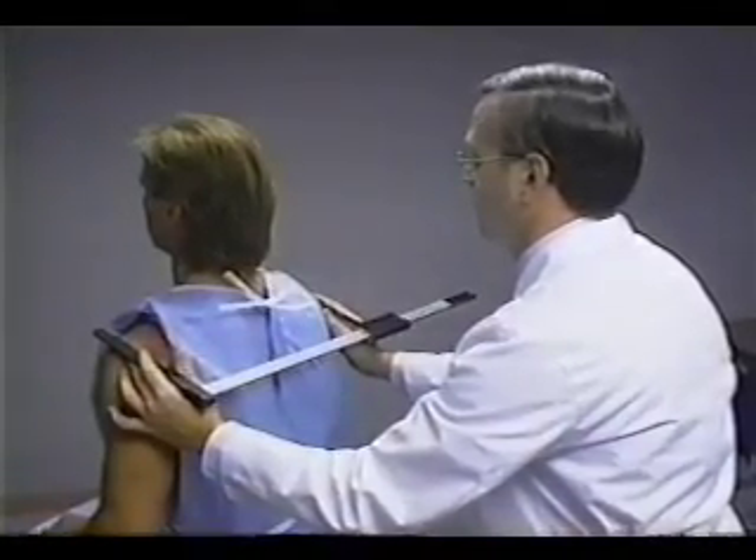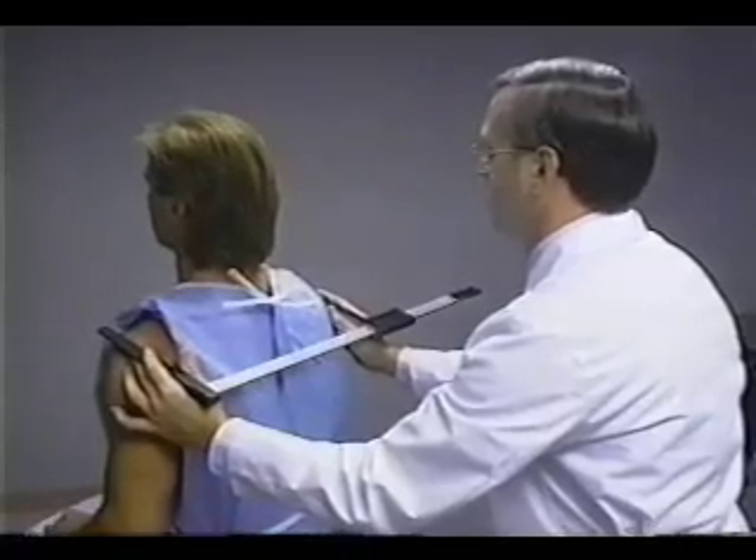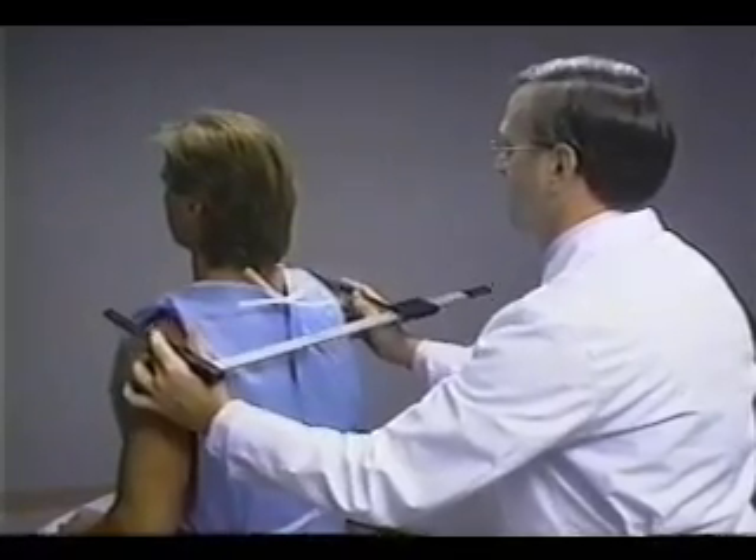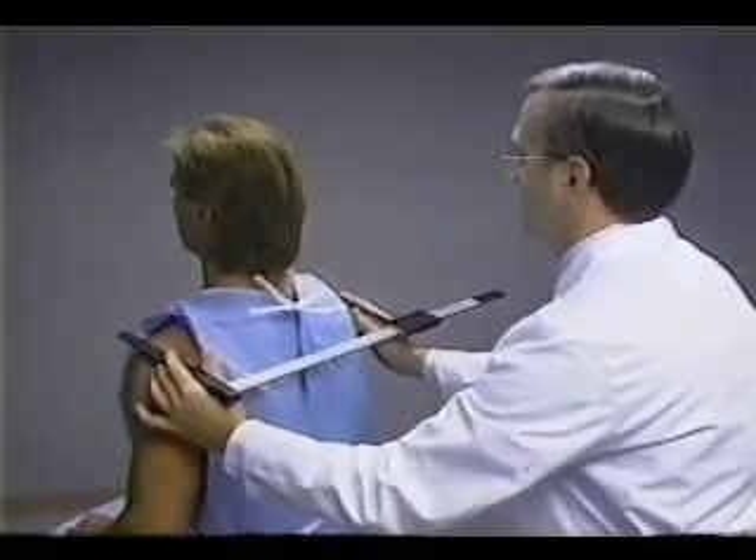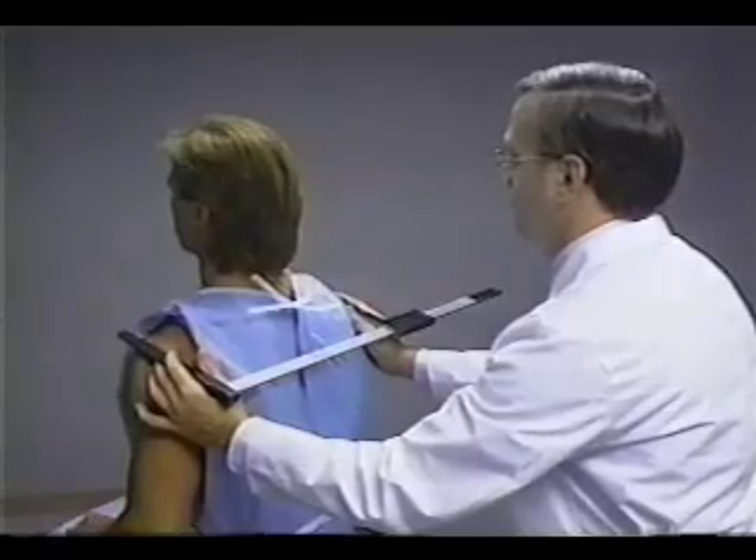Pressure is applied to compress the soft tissue without inducing pain. The maximal breadth across the lateral borders of the acromial processes is measured in centimeters to the nearest millimeter.